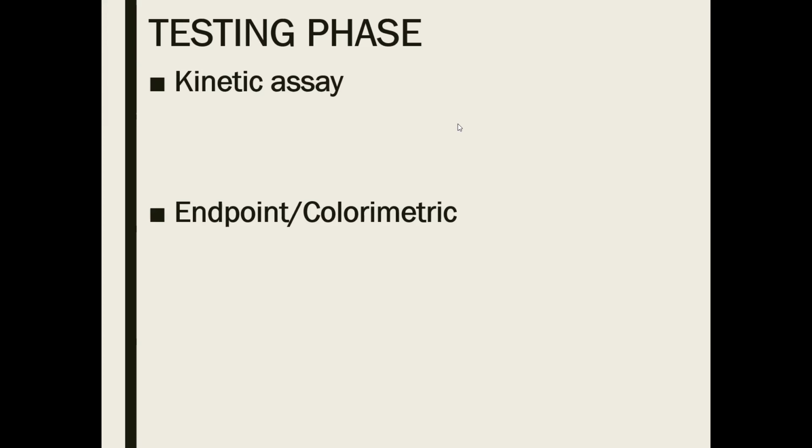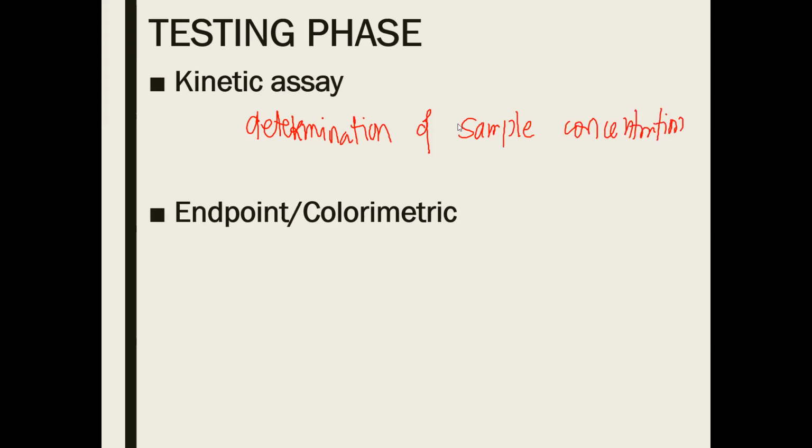Kapag po sinabi natin kinetic phase, this is the determination of sample concentration based on change in absorbance over time. Again, when we said kinetic assay, no, this is a principle, no?